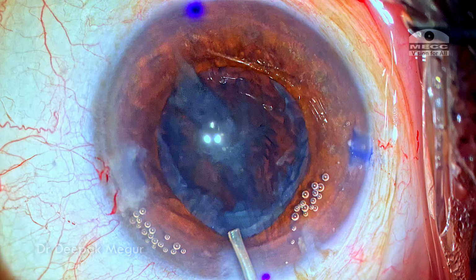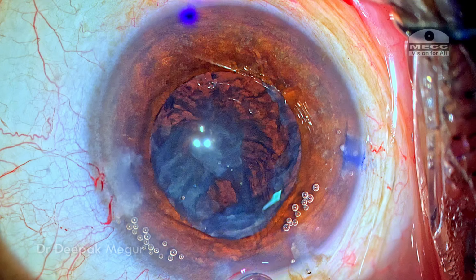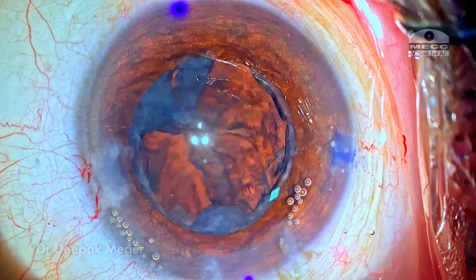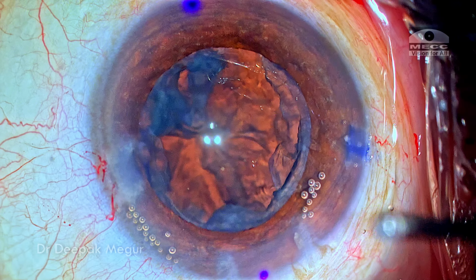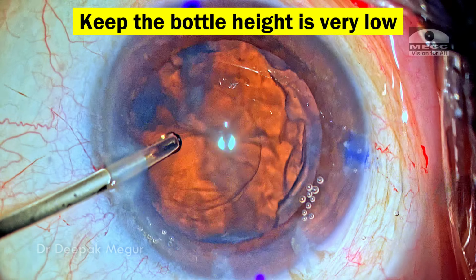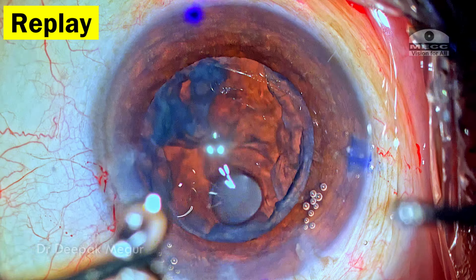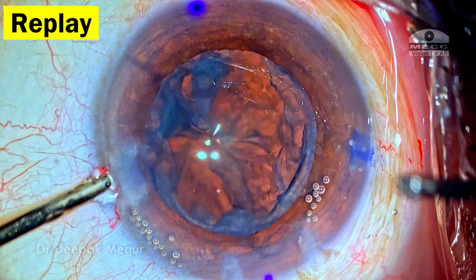Gentle irrigation is being done just to loosen all the epinucleus which is there. And then the chamber is filled with OVD, and then I'm going in with the bimanual irrigation aspiration. Again, to prevent the reverse pupillary block, as I'm entering the eye, I keep the bottle height very low. I begin with a bottle height of just 30 centimeters. That's what I'm trying to check before introducing the irrigation cannula. We're just seeing trickling of fluid.